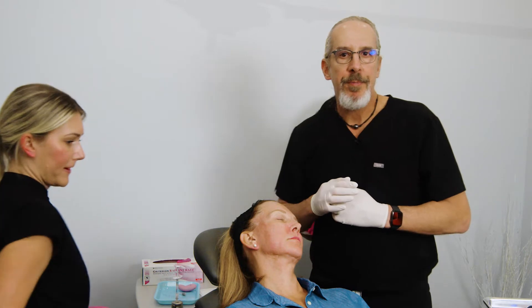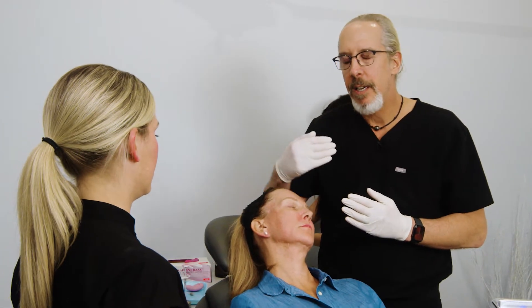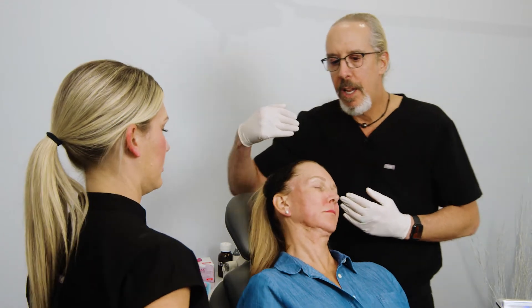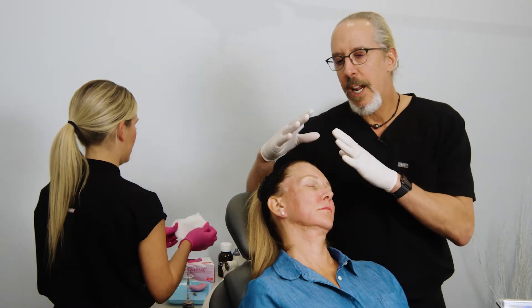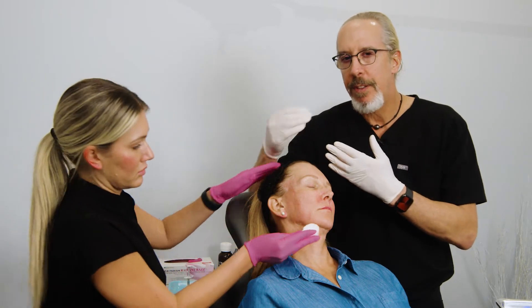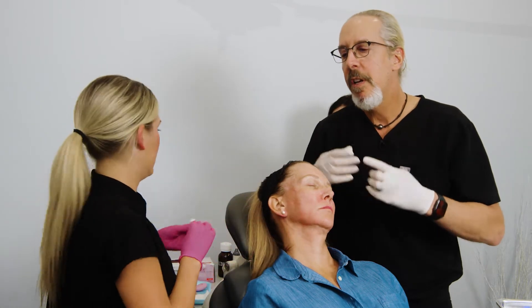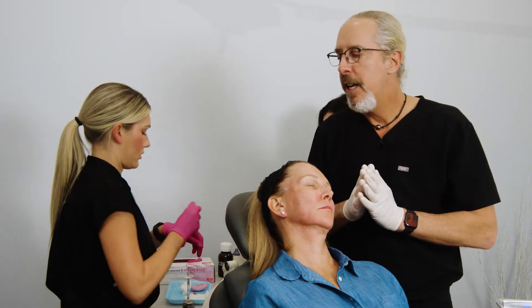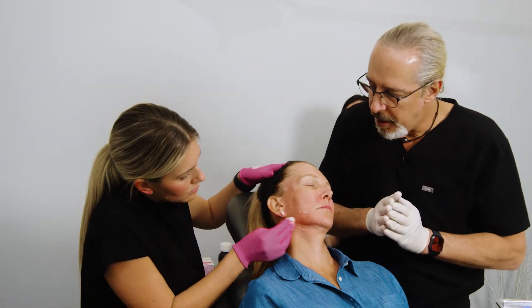This is a very safe injection down to periosteum. When you inject the angle of the mandible you're injecting onto periosteum, but with the movement of the masseter it actually gets involved into the masseter muscle. It spreads, and that's okay - it still gives a great improvement in the gonial angle.